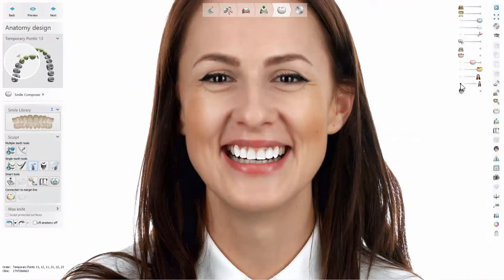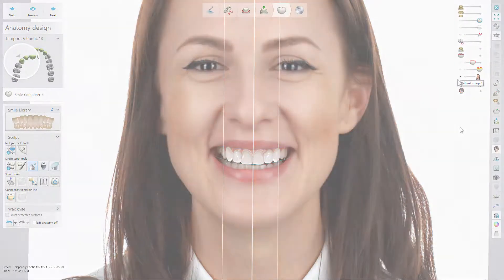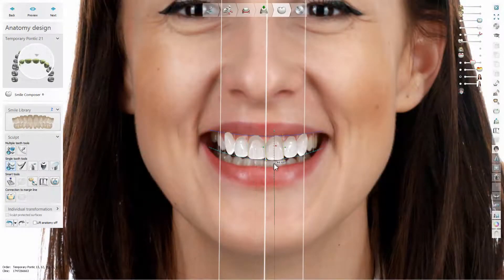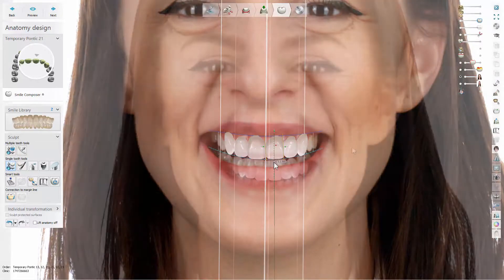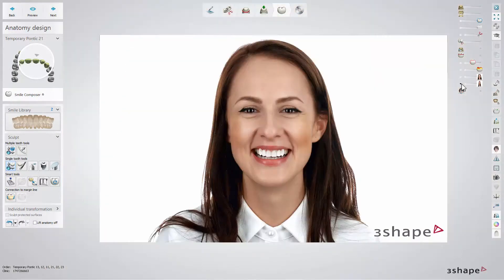Once both are aligned, you can freely switch between these pictures. Use the Smile Design picture to guide the restoration design according to the treatment plan, and use the Smile Picture to assess the design.